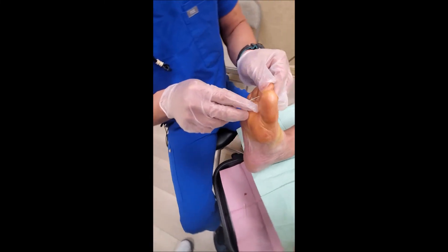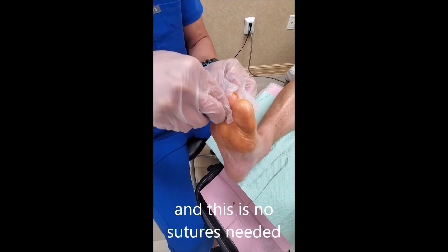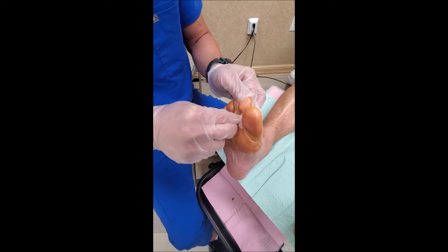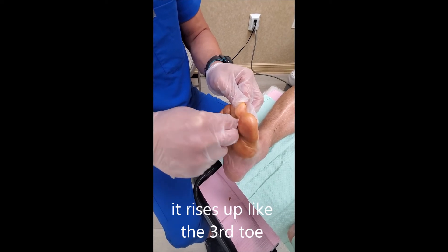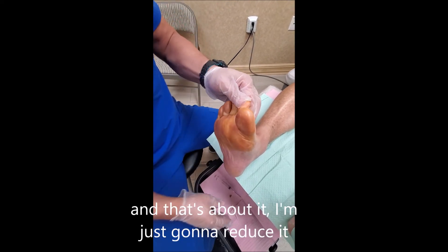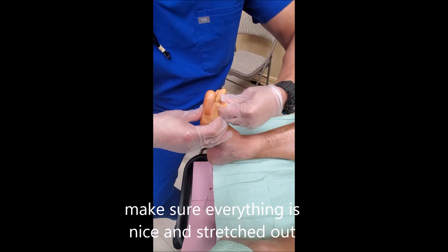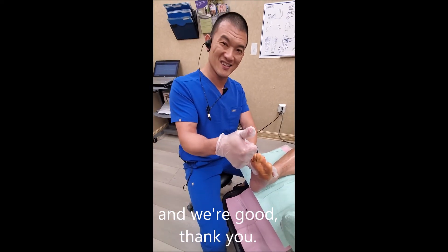Double-check a few other things. No sutures are needed because we're not opening up anything, and we just want to make sure that it rises up like the third toe. We're going to reduce it, make sure everything's nice and stretched out, anything that's still tight — and we're good. Thank you.